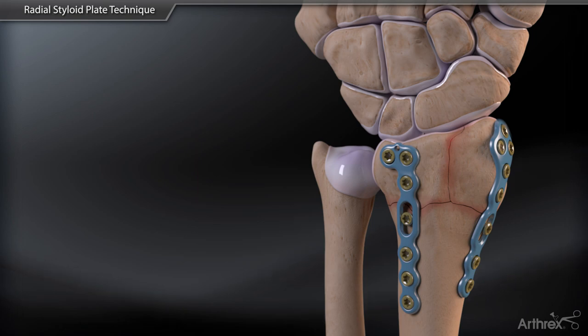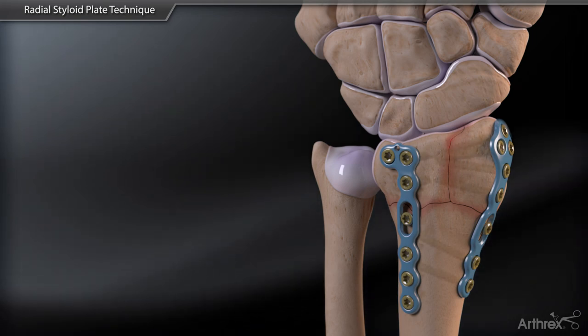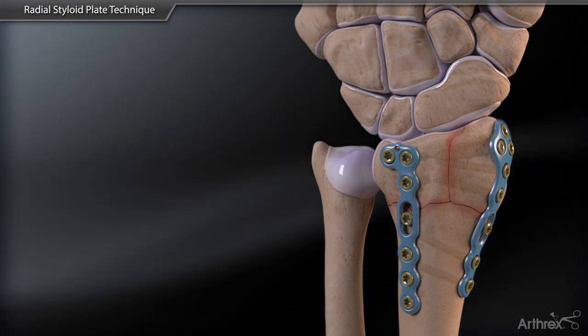Confirm final fragment reduction, plate placement, and screw trajectory on fluoroscopy to ensure satisfactory reduction.